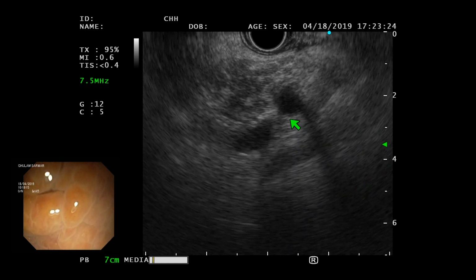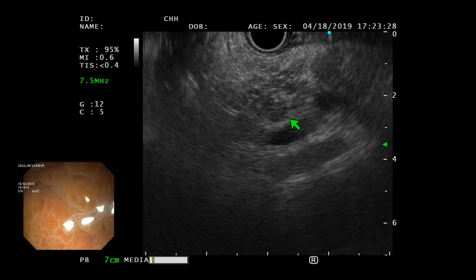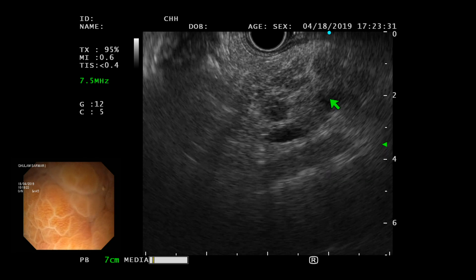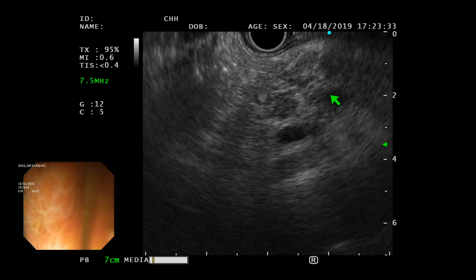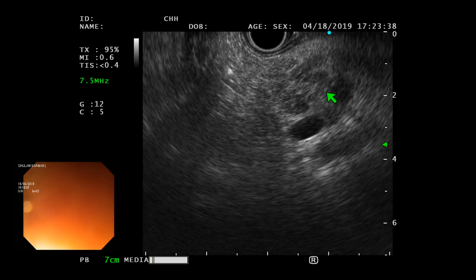So what you need to do is gently advance the scope. Now you see how nicely the pancreas comes, because now the splenic vein is right underneath and the splenic artery is there. From here, rotate to the right, and you see the duct right there too. Okay, keep rotating, keep rotating.